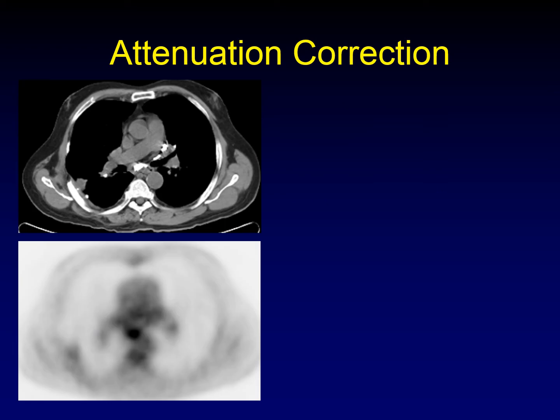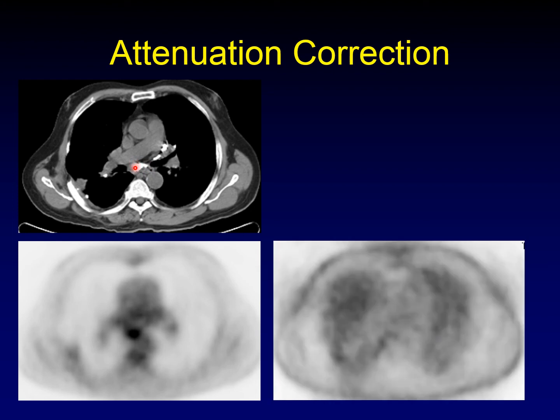Attenuation correction is very useful, but it also produces artifacts that you have to be aware of. For example, here's a PET-CT where you can see very focal uptake in the mediastinum just below the carina. But this is an artifact — it's produced by the calcium in this subcarinal node. When we look back at the non-attenuation corrected images, we can see there really is no super-physiologic uptake in that vicinity. This is why it's really important to always have the non-attenuation corrected images available when interpreting the attenuation-corrected images.